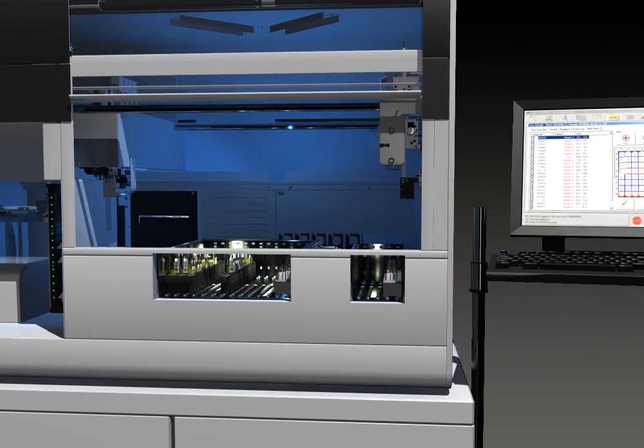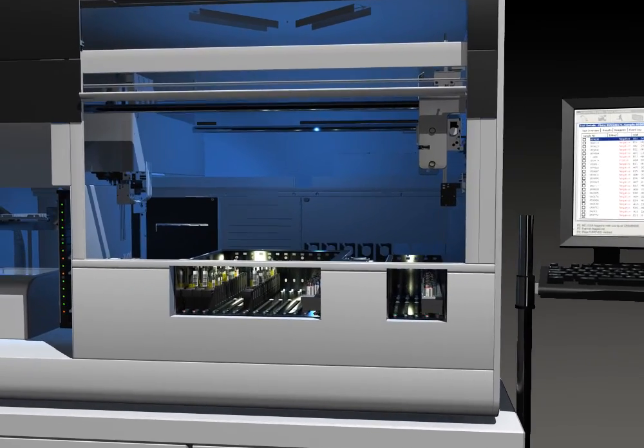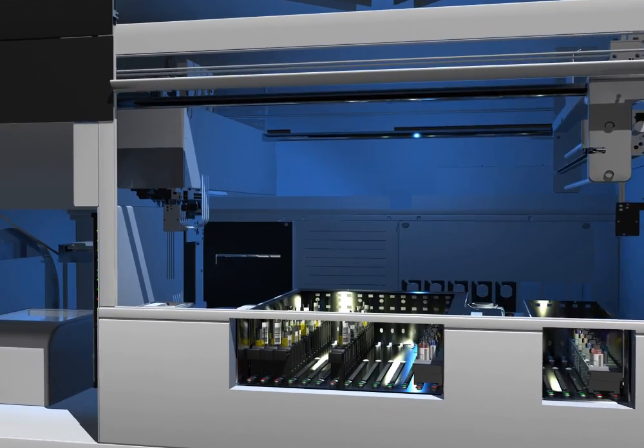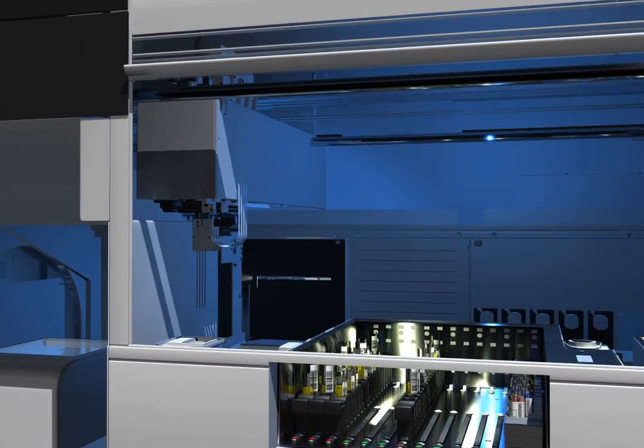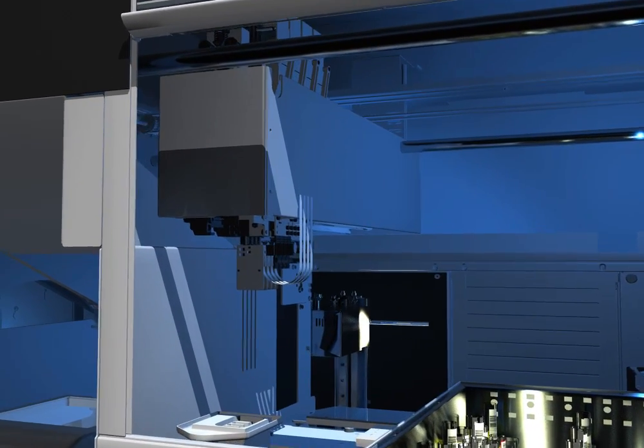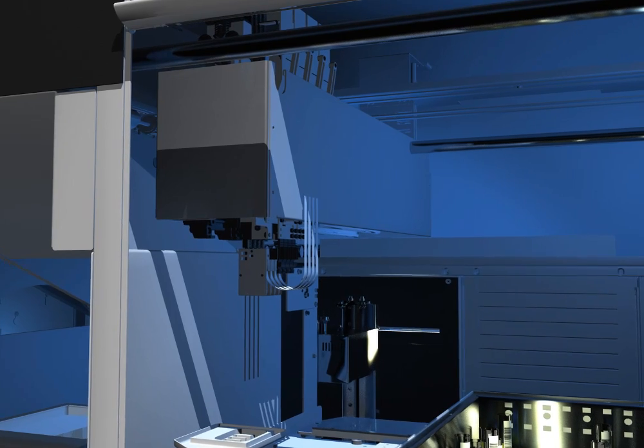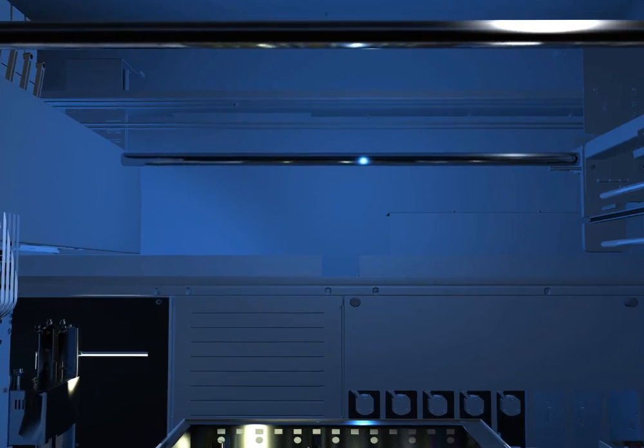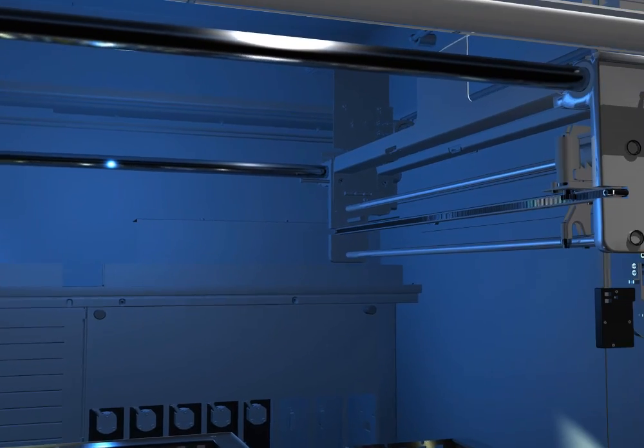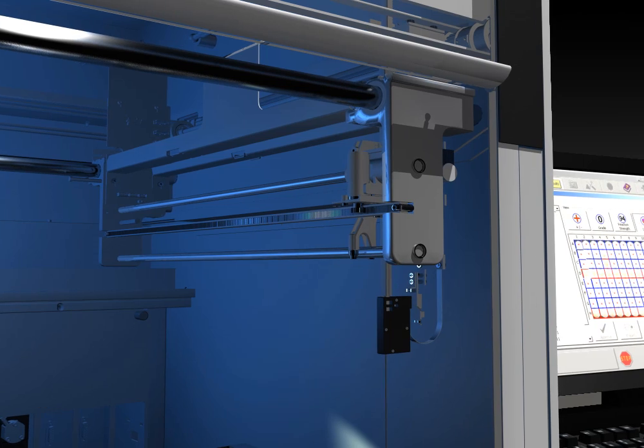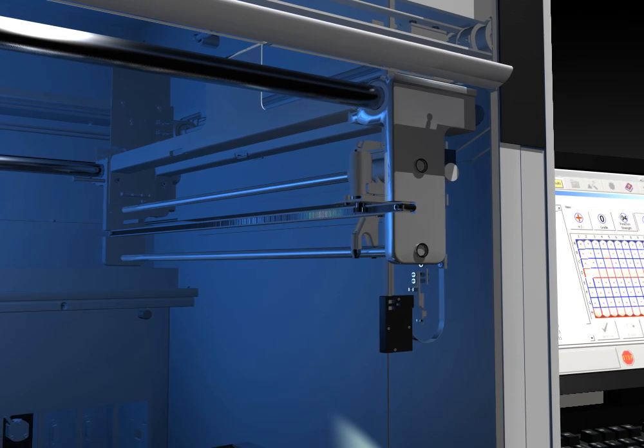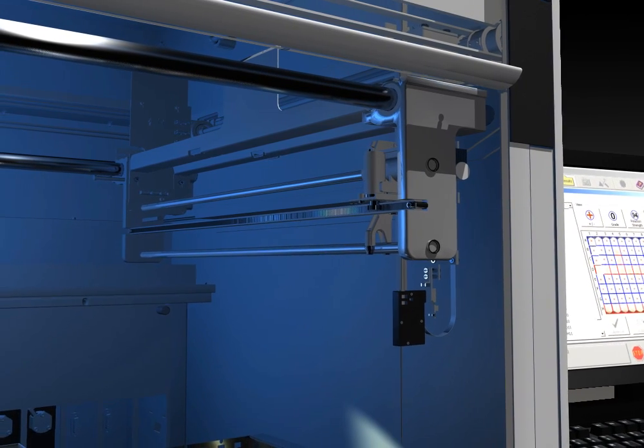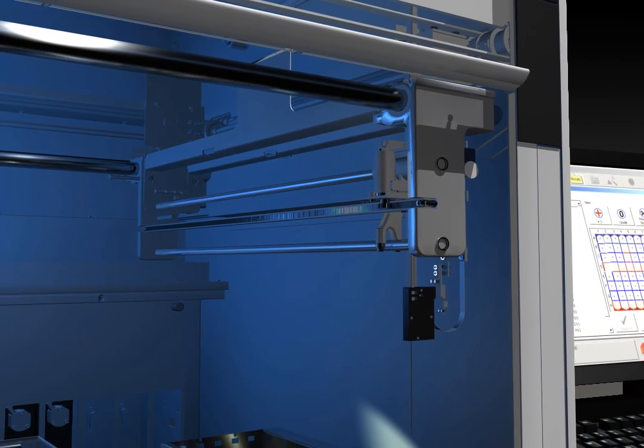NEO features two arms for pipetting. There are also two pipetting stations. The left arm pipets samples and it has four probes. The right arm pipets reagents and it has a single probe. By using two arms and two pipetting stations, we can pipet multiple plates at one time.